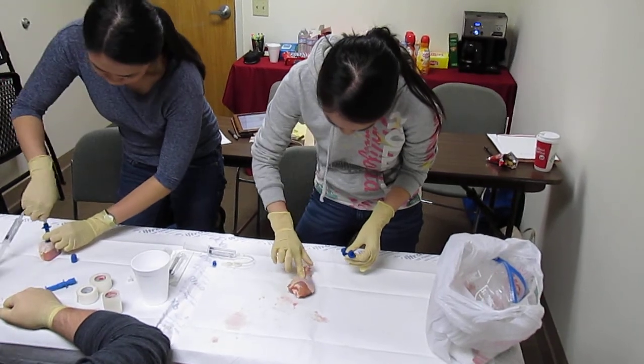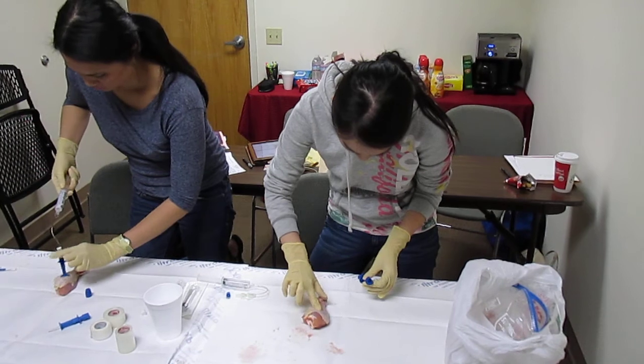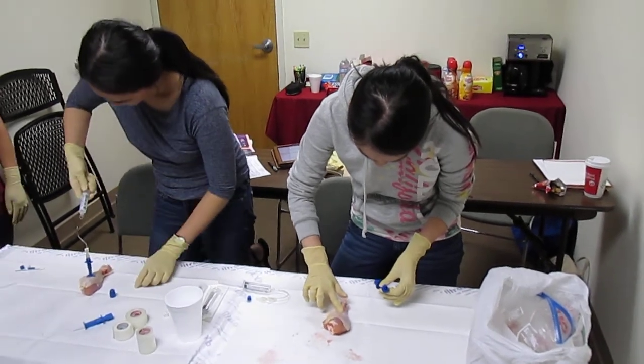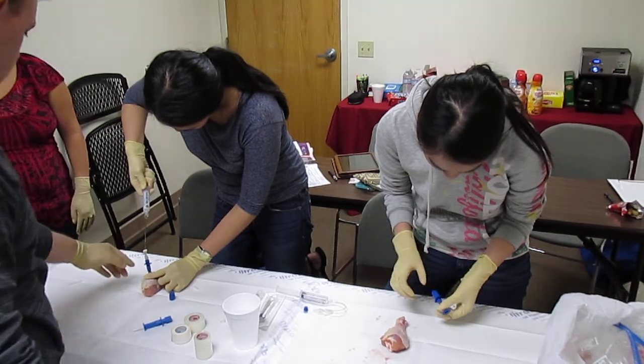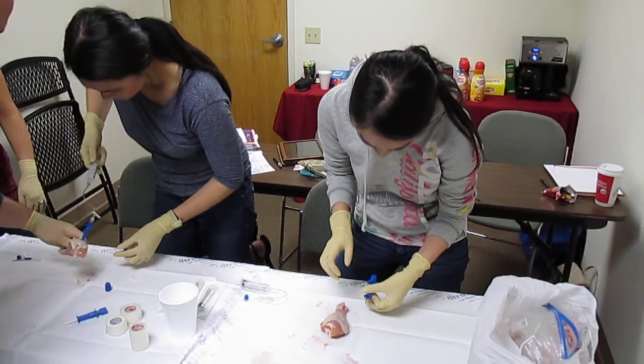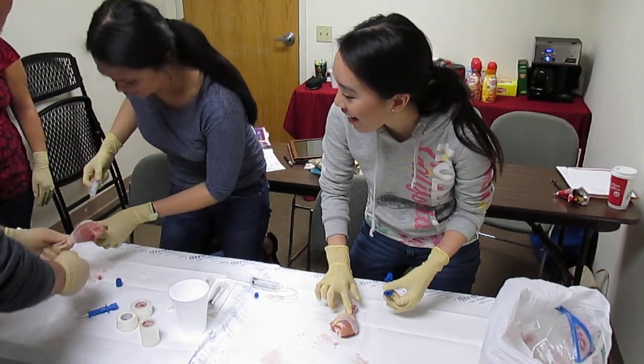Some will put a three-way stopcock on instead of just a lock like that. It's up to you guys, depending on what you think you're going to push. So you aspirate. And then let's pick up and look right here and push. So it's only on the leg. There we go.